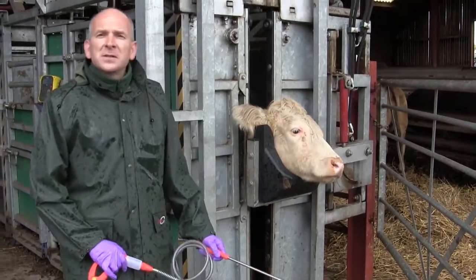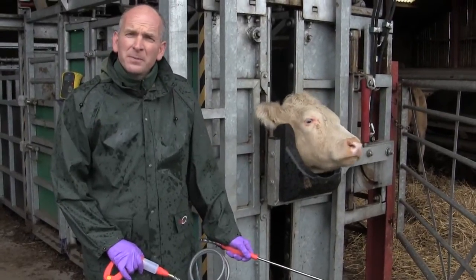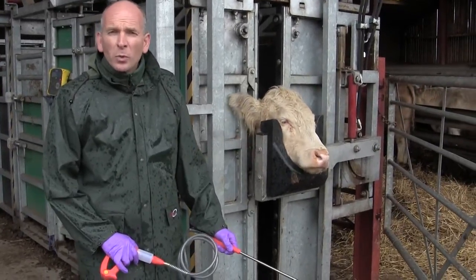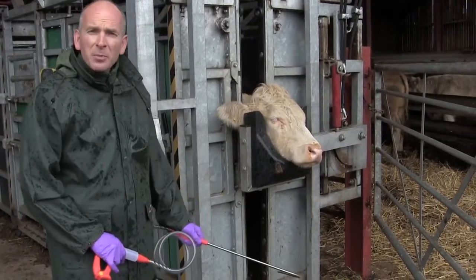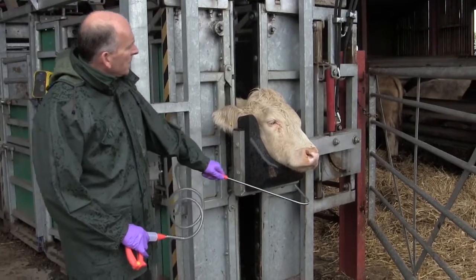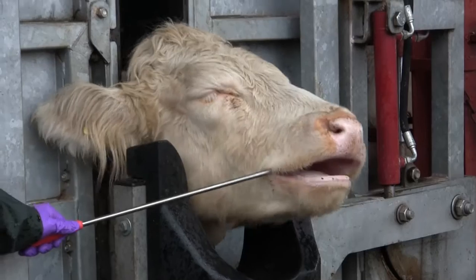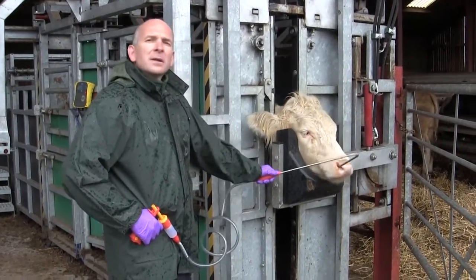All drenching is designed to deliver the wormer dose over the tongue to the back of the mouth, and the dose should be swallowed all at once to optimize efficacy. When dosing an animal with an oral wormer, it's important to have the animal adequately restrained with the head held up. Once the animal is restrained, introduce the worming gun into the side of the mouth, over the back of the tongue, and depress the plunger so that the wormer is delivered as a single dose and will be swallowed.